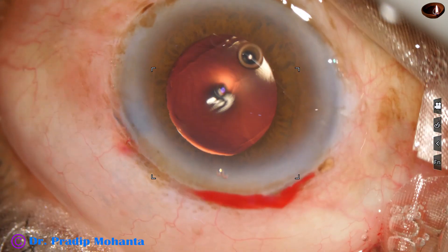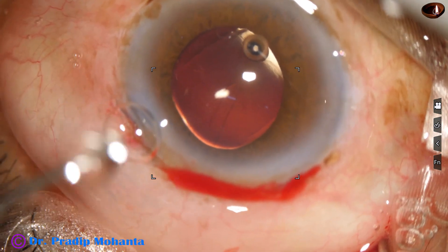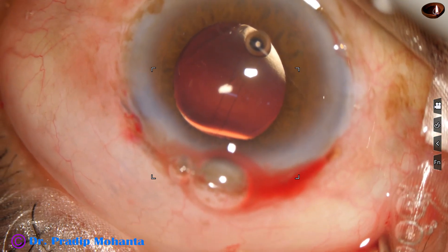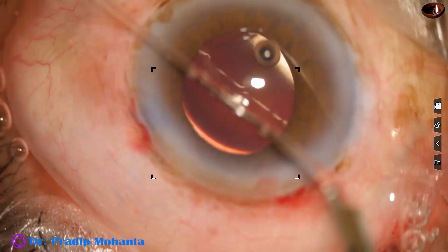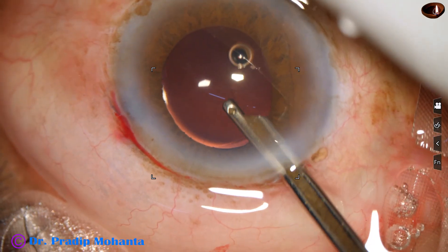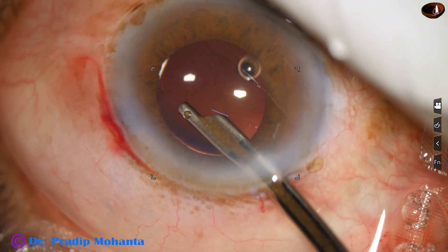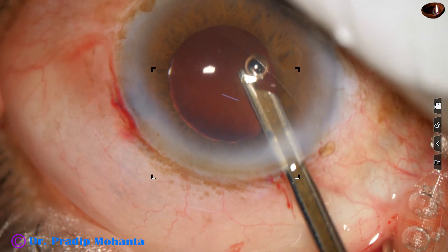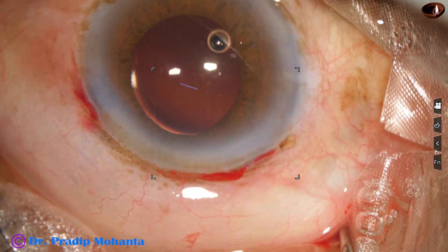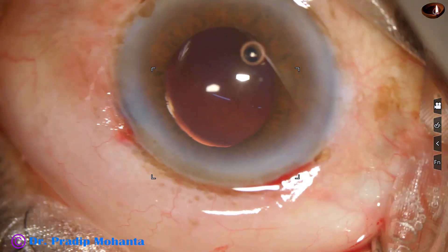This is moxifloxacin. The side port is closed by hydrating the corneal stroma very gently — I hydrate only minimally. My side port is a little wider and does not need much hydration. If the side port is small and the wound is stressed during introduction of instruments, there is fish-mouthing and it takes a lot of stromal hydration to close. The anterior chamber is nicely formed, wounds are checked, and the case is concluded.